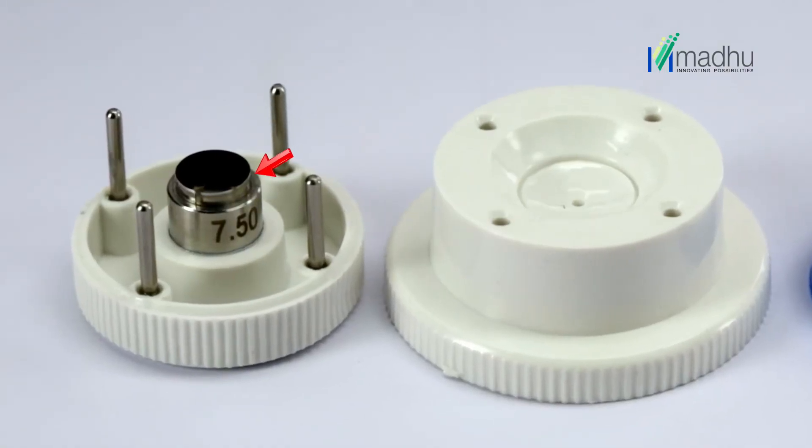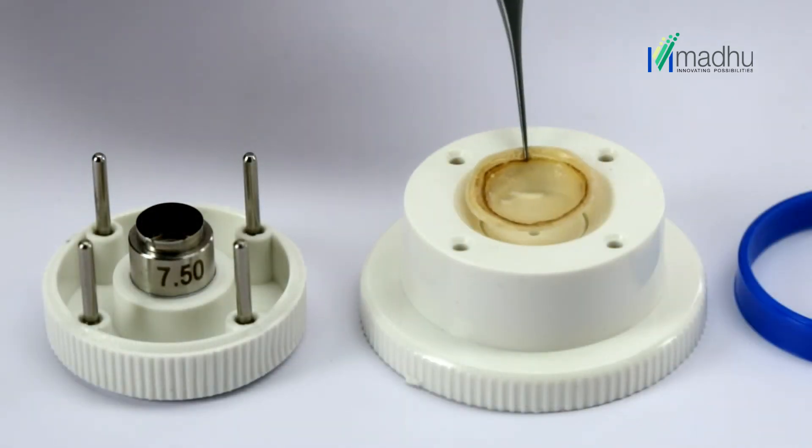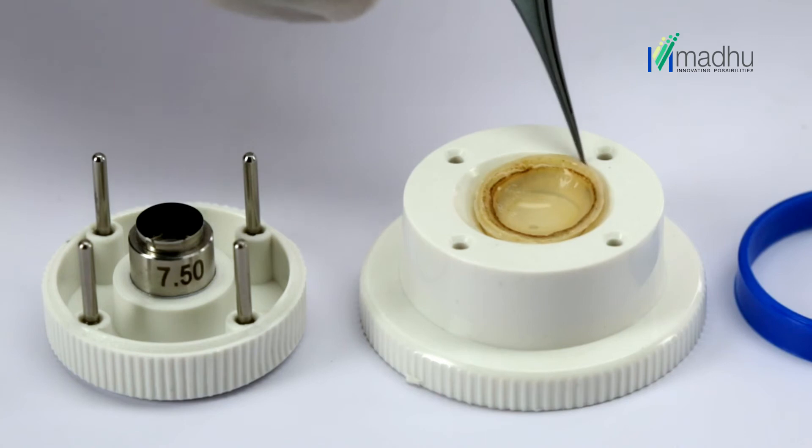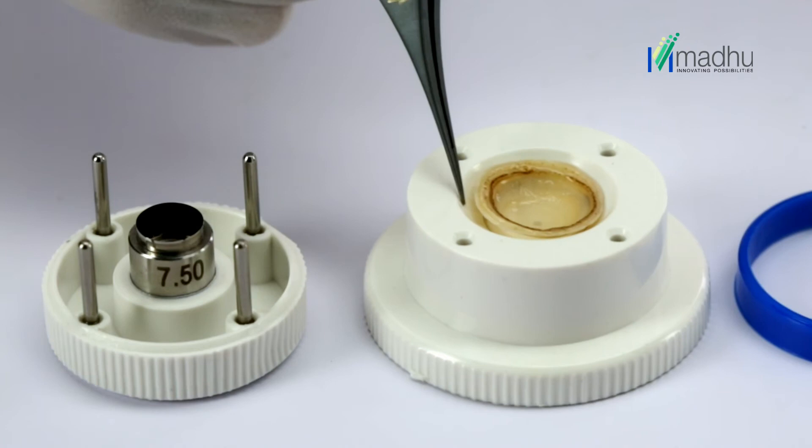Again, verify the blade diameter, which is engraved on the SS trephine. Now place the donor cornea in the well of the cutting block with the endothelial surface up, and center the donor cornea with a fine-toothed forcep.